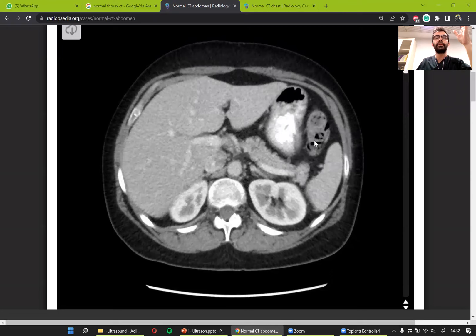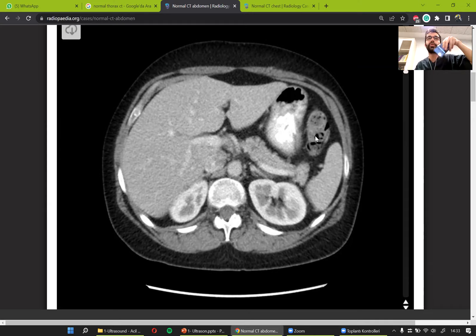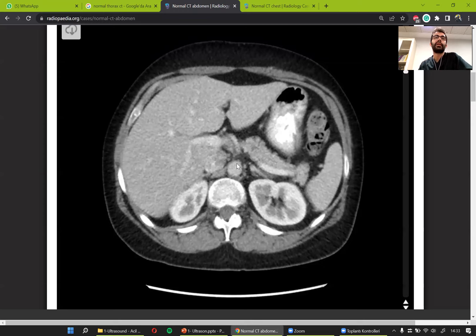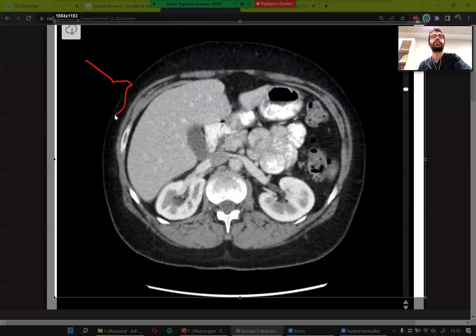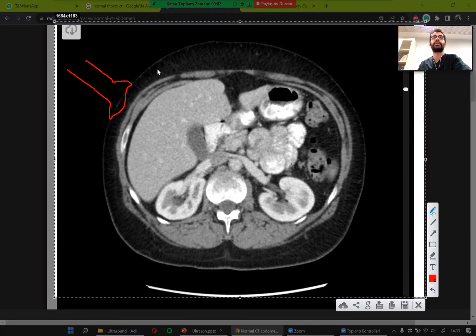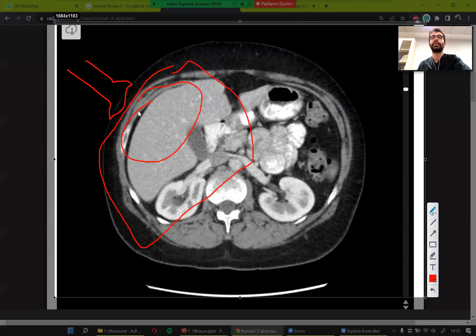Before the ultrasound lecture: in an ultrasound scan, we will be looking at the patient from a probe — like a camera. Wherever you put your probe, it shows you only that area, so it is much easier to get lost in an ultrasound scan. You really have to know where you're looking. I want to show you this orientation. If I put the probe here on the lateral side, it will produce an image roughly like this.